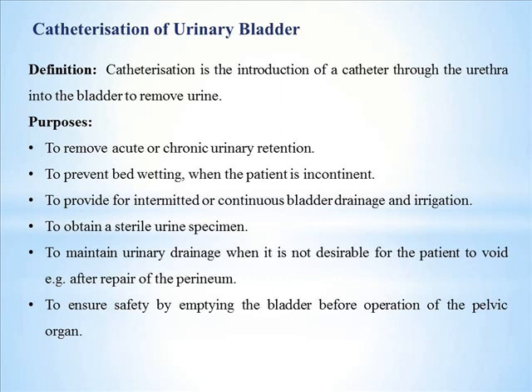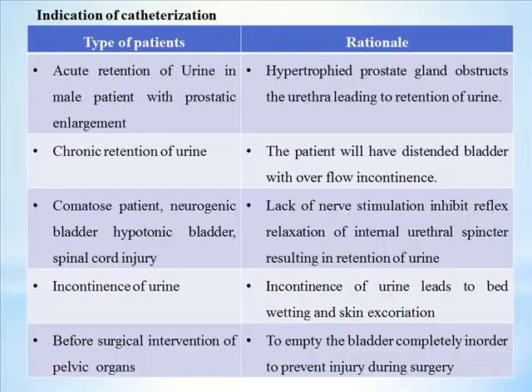Number 5 is to maintain a urinary drainage when it is not desired for the patient to void, for example, after the repair of the perineum. Number 6 is to ensure the safety of emptying the bladder before operation of the pelvic organ.